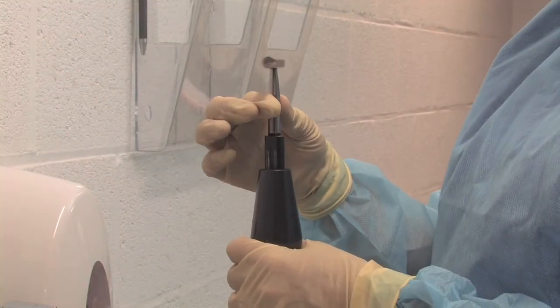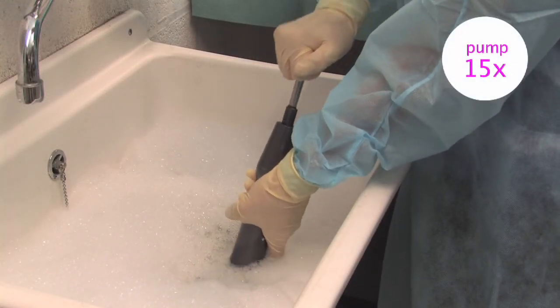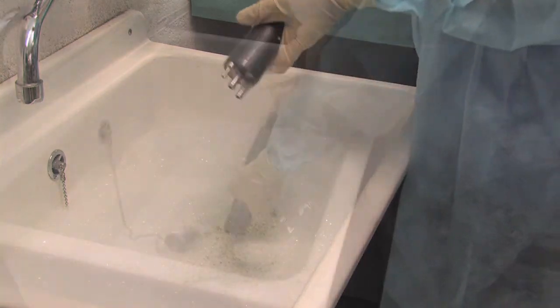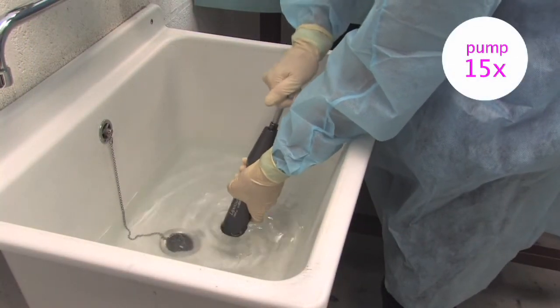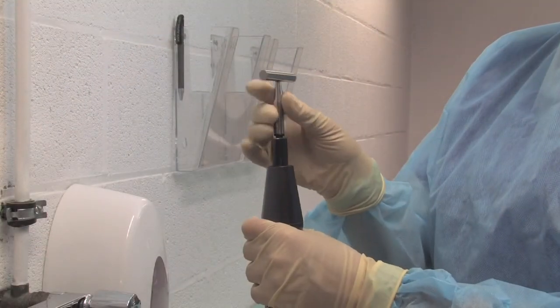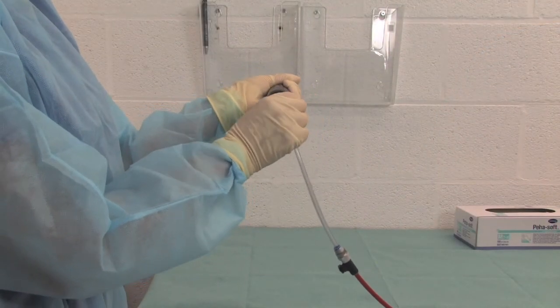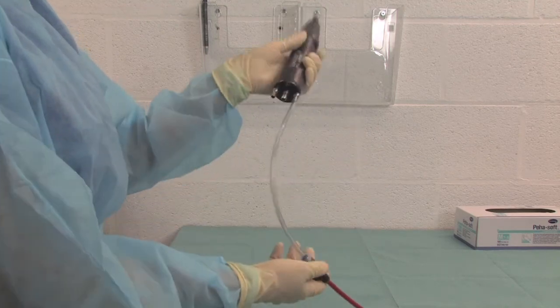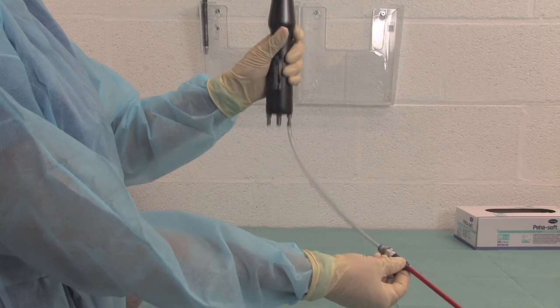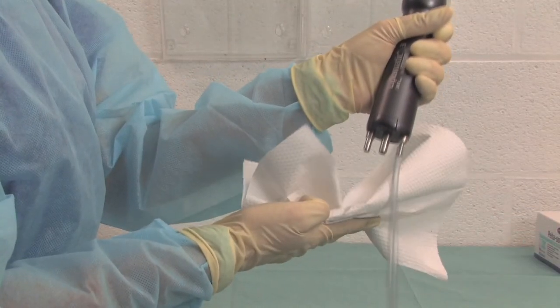Screw the cleaning key on the Lipomatic. Pump minimum 15 times with the T key while the 3 connectors are immersed in the hot soapy water. Repeat the operation in the hot clear water to rinse the engine. Unscrew and remove the T key. Use compressed air to dry the Lipomatic engine. If compressed air is not available, you may use the air tubing left on the SP6 for this purpose. Use until the air going out is perfectly dry.